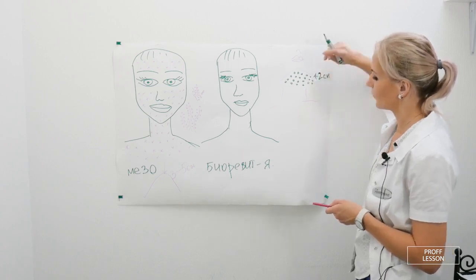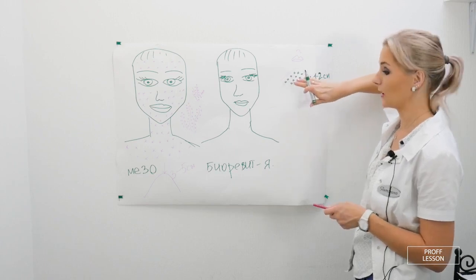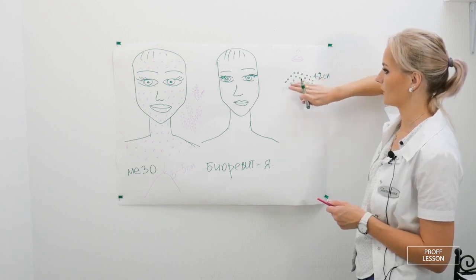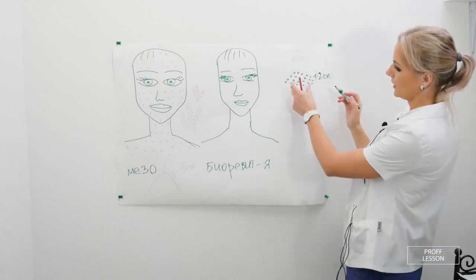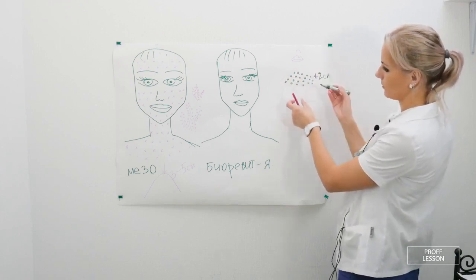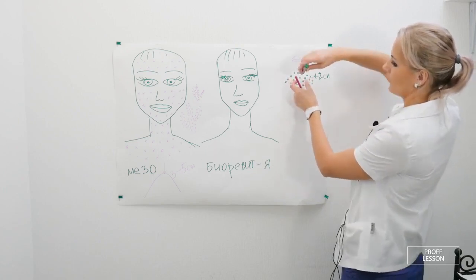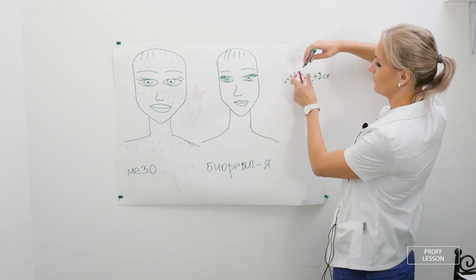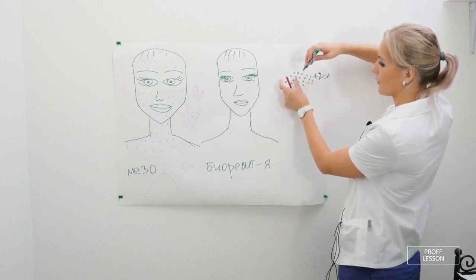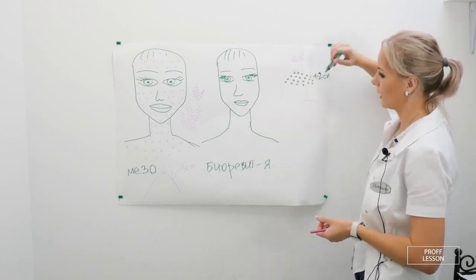Then, of the amount of drug that we took for the second chin area, for example 1 milliliter, we go papularly over the entire surface of the second chin, and then clamp the fat fold. After the papular technique, whatever amount of drug is left, we inject perpendicularly into the fat fold. So we take the center one, and for example the side and the other side, and we inject all of the remaining drug into the fatty tissue in the chin area.